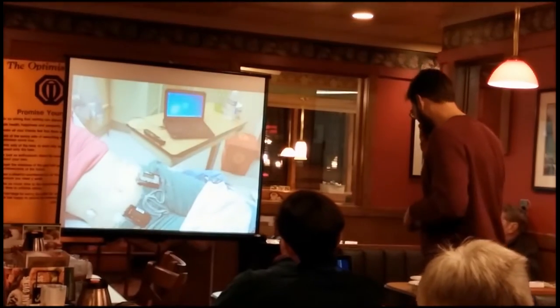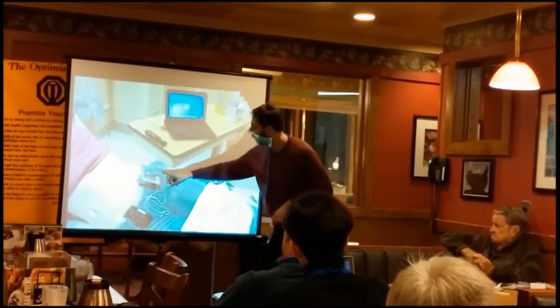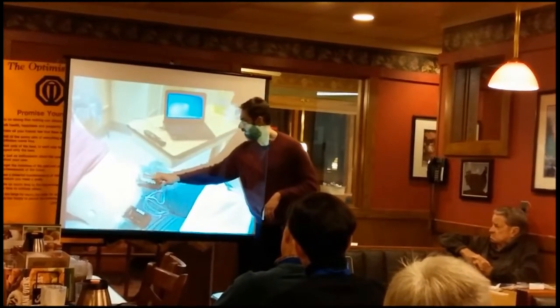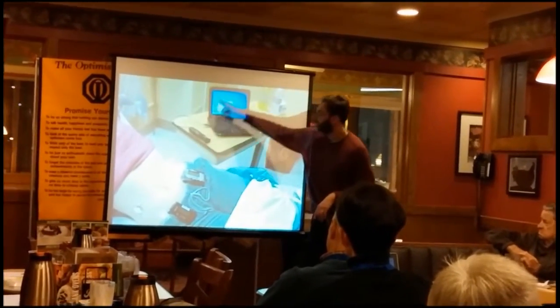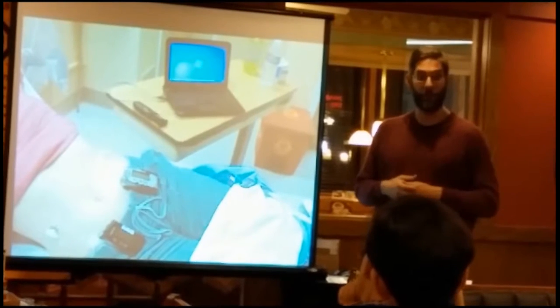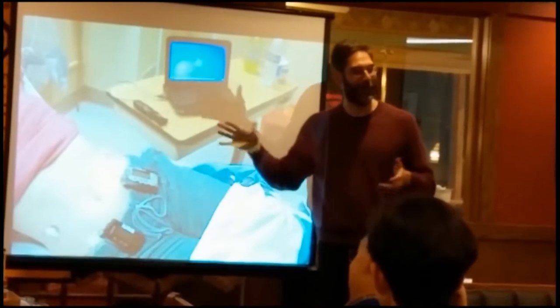So what's this system look like? You've got the pump, right, with insulin going in. We've got, for the study, 2 devices. This was the continuous glucose monitor sending the data here. And then you have the glucose information going to the computer that had the algorithm to then tell the pump how much insulin to turn off if you started approaching a low. So anybody see problems with this? Well, right? This isn't a commercial product, is it?